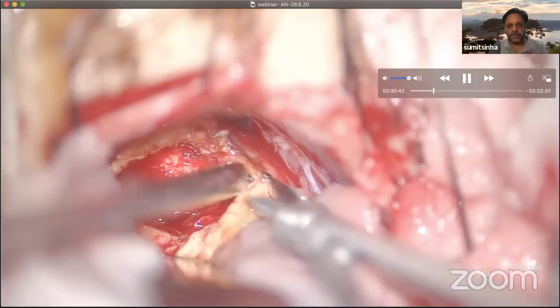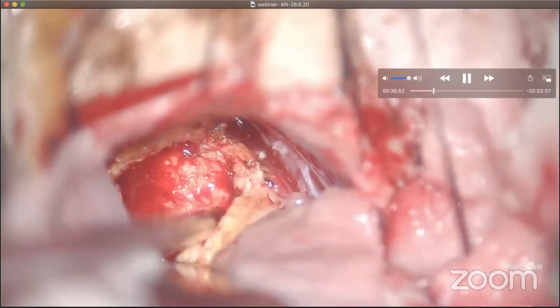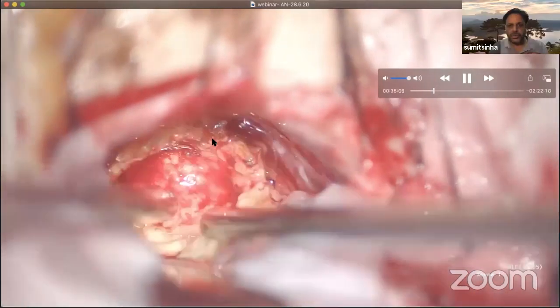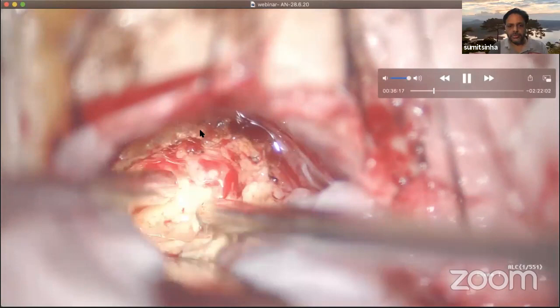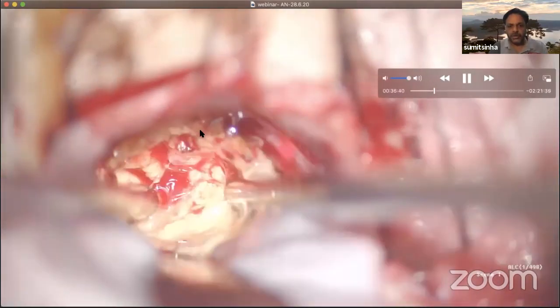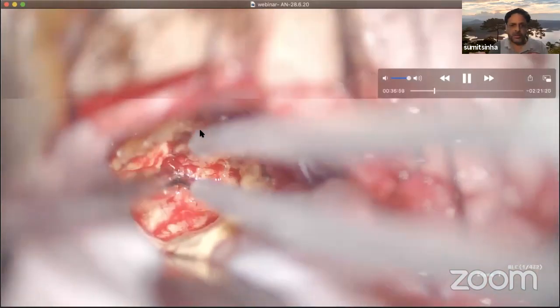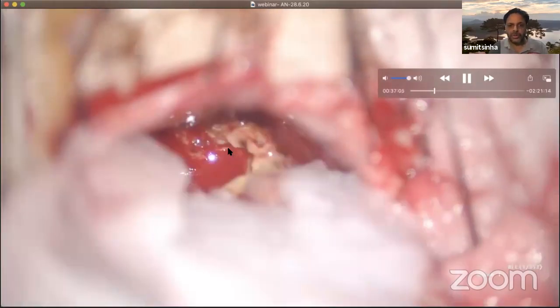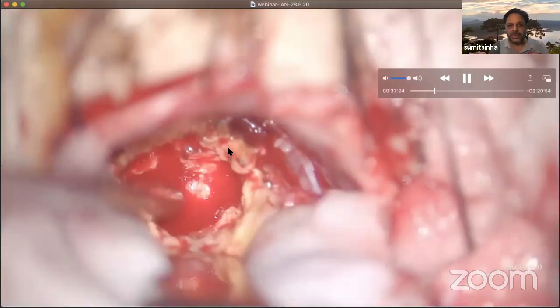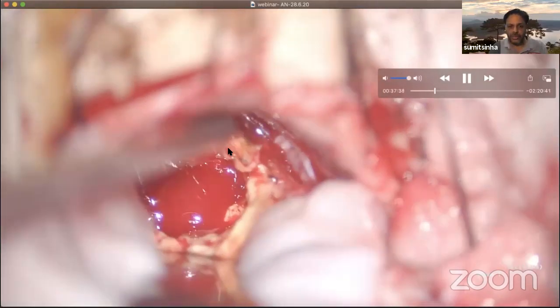So, cutting more of the tumor, de-roofing the tumor, cutting the tumor capsule, and then applying the CUSA, removing more of it, making it manageable, making it thinner so that it collapses more and gives me space outside so that I can dissect and defloor the arachnoid more from the tumor capsule. This is how it is done.